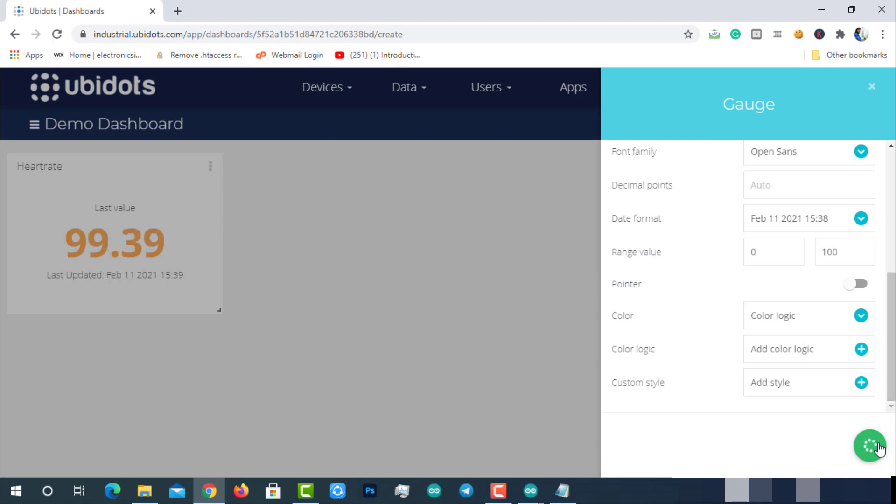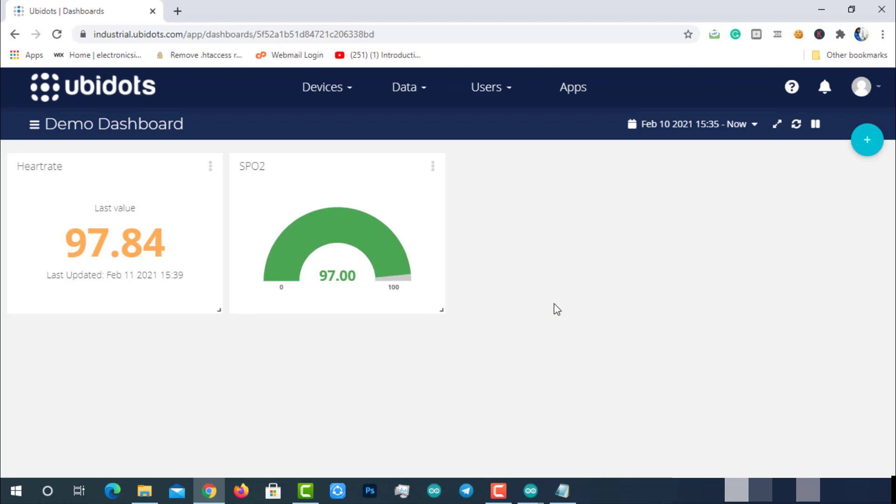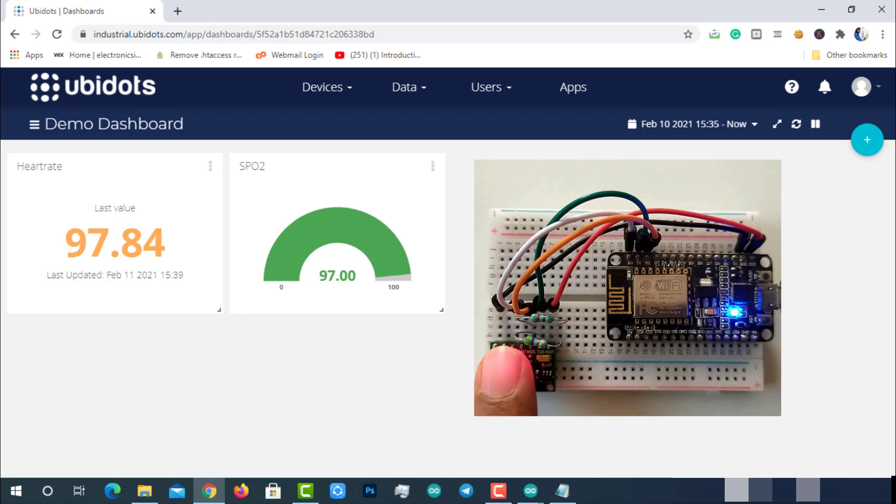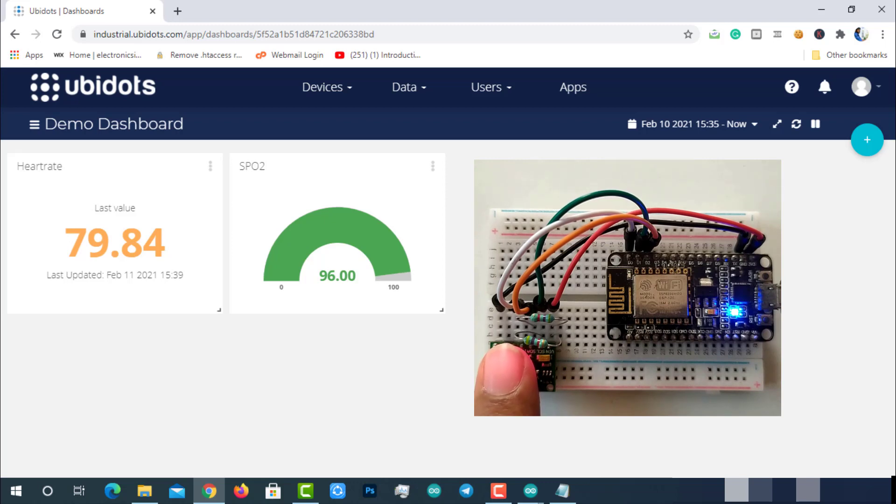After creating, you can see the live data in green color on the gauge because it is greater than 95%. If that value is less than 95%, you can see it in red color.